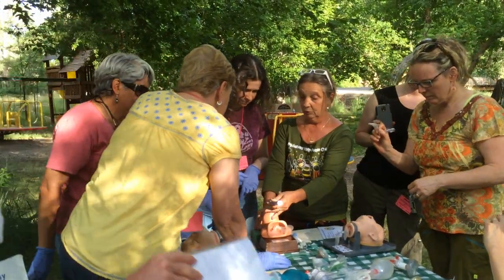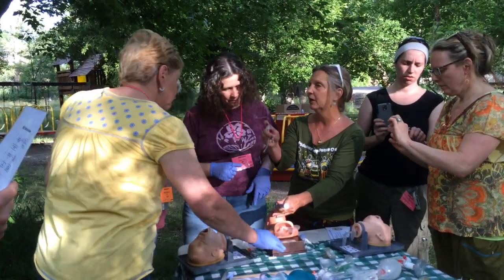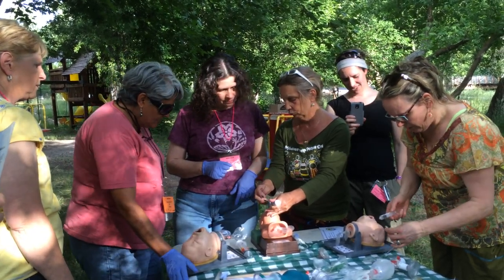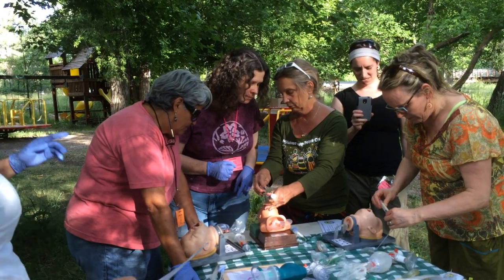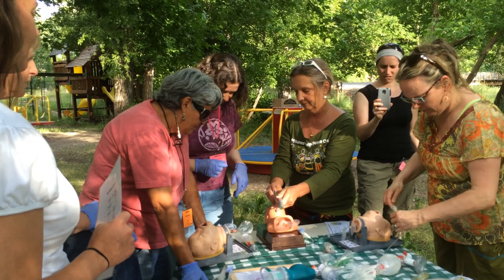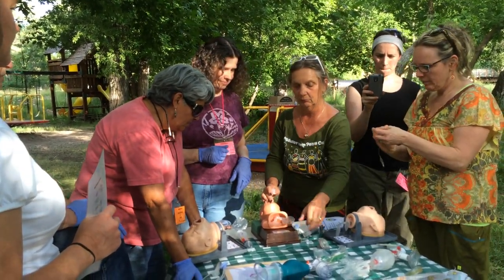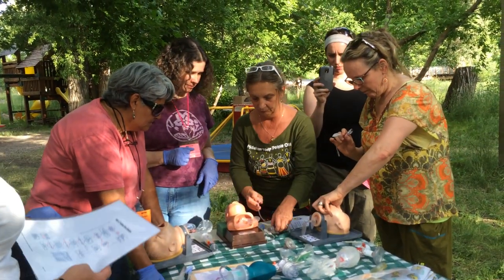So then you would take this and put it right between the vocal cords. Are we going to be tested on the laryngoscope? No. Then you turn this off, take this out, put this on, and bag your baby. This is so much better.